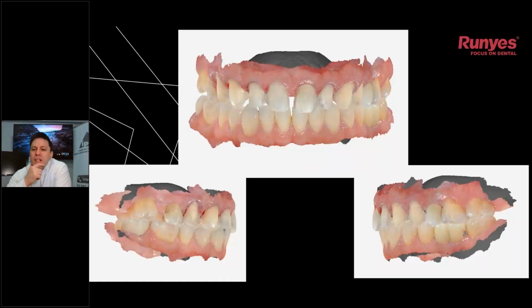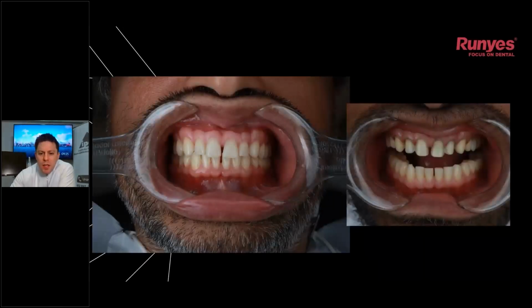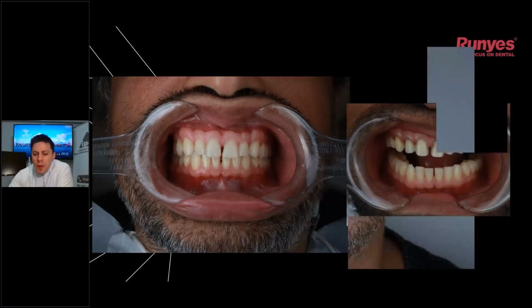We did a preparation in this patient. We did a full set of veneers from premolar to premolar in this case, 9 elements. We did the preparation on the patient. This is how he looked. This was our preparation, and this is our final result for our patient.